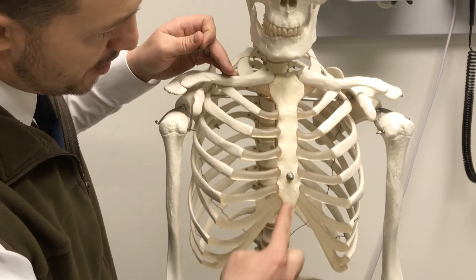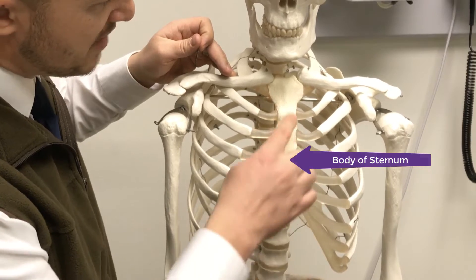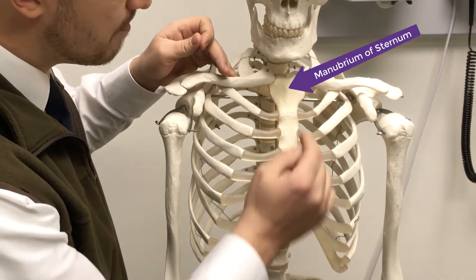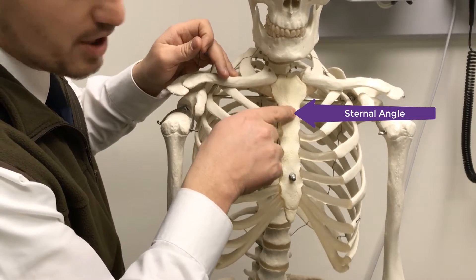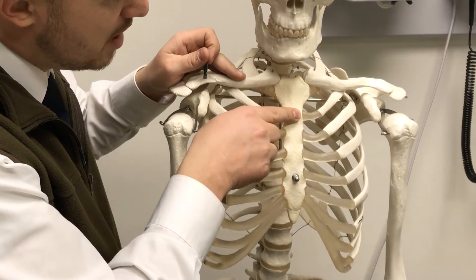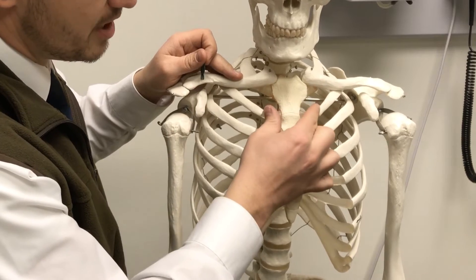Using one of these electrodes and our skeleton here, I want to show you where you're going to place these before we get to our real patient. As you can see, we've got the sternum. The body of the sternum is this lower part with the xiphoid process sticking out at the bottom. The top part, the top couple of inches, is called the manubrium. And here there's a small little angle or ridge called the sternal angle, and the sternal angle is what we're going to be feeling for on our patient. As we feel that sternal angle, we're going to go off to the side and notice that we're right on rib two.